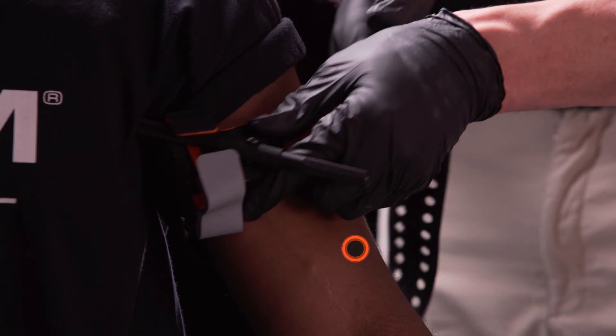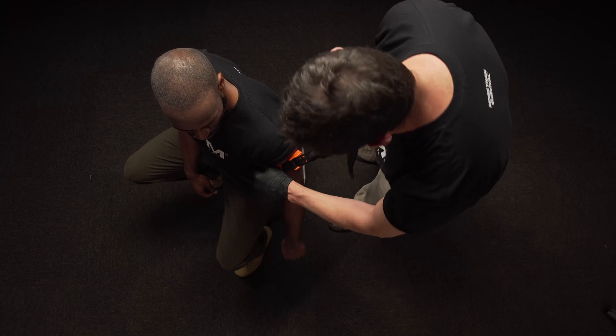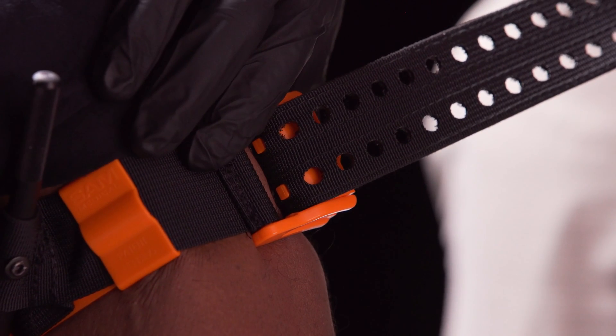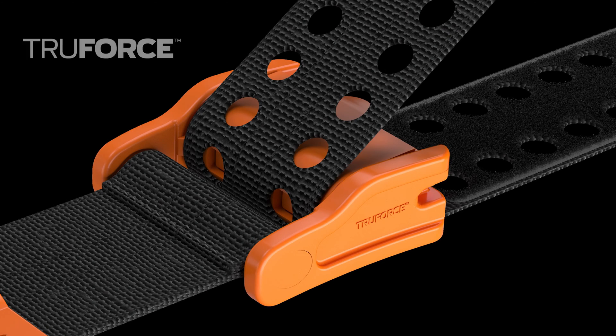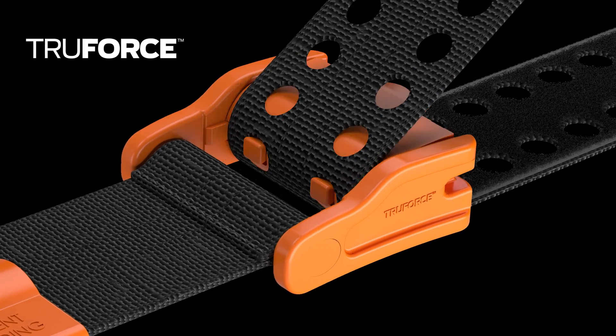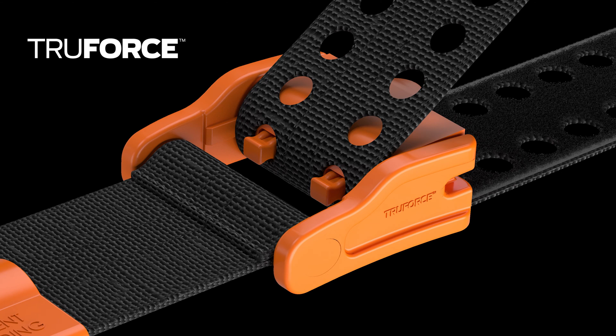Next, grip the Precision Strap close to the buckle. Pull hard and steady against the TruForce buckle until the strap stops. Depending on the environment, you may hear an audible click, indicating TruForce is activated. The TruForce buckle technology auto-locks by activating prongs, eliminating slack typically found in all other tourniquet applications.